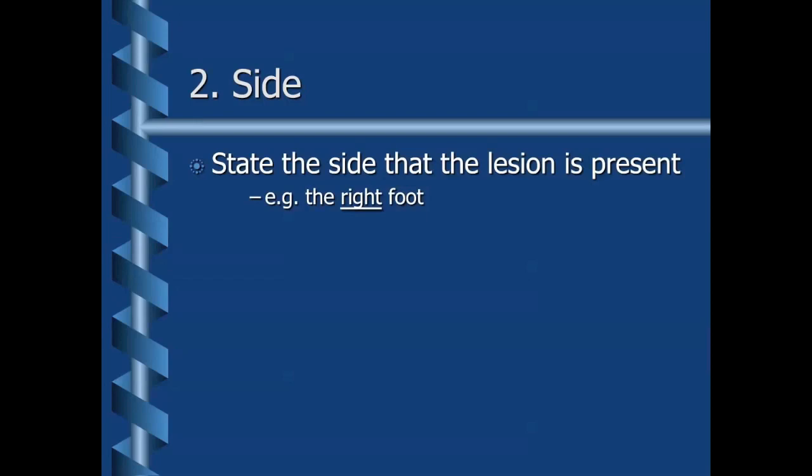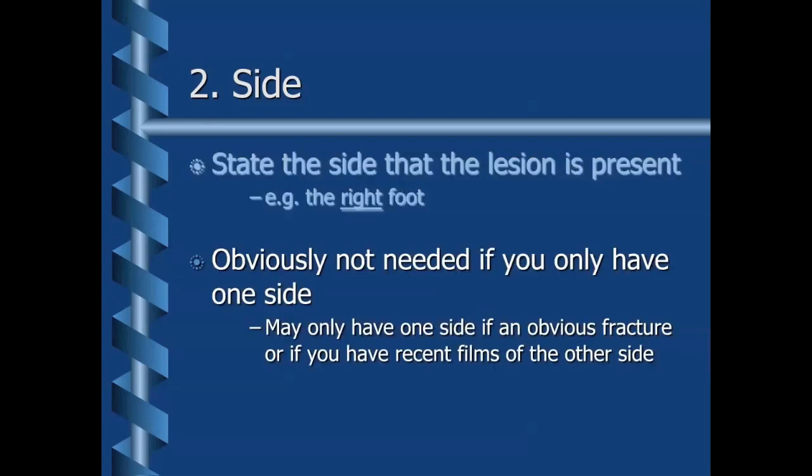The next issue we need to consider is the side, and you need to state the side that the lesion is present, for example, the right foot or the left foot. Now, that seems blindingly obvious, but you will be surprised how many people won't do this. So just assume that the person reading the notes will not know. It's obviously not needed if you only have one side of x-rays. So if you only have the right foot, then you obviously don't need to state the side.